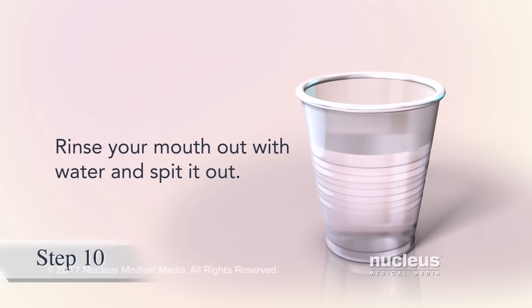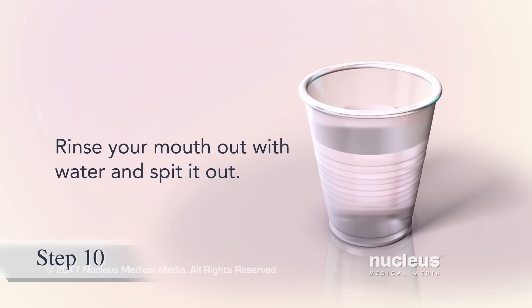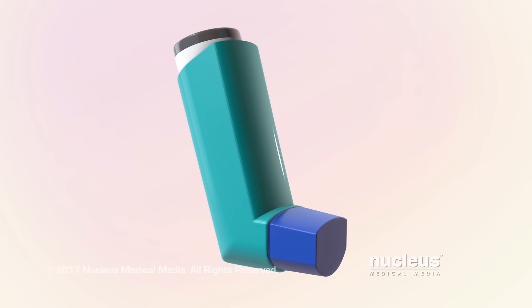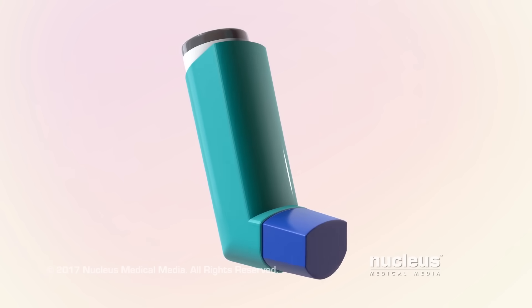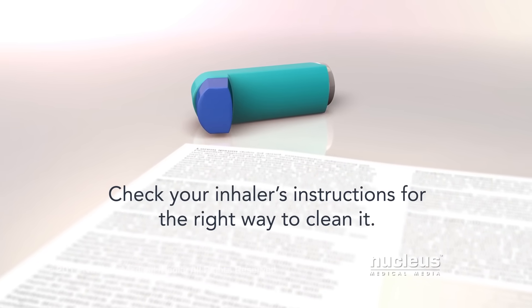After using a steroid inhaler, rinse out your mouth with water and spit it out. It's important to keep your inhaler clean so that it works properly. Check your inhaler's instructions for the right way to clean it.